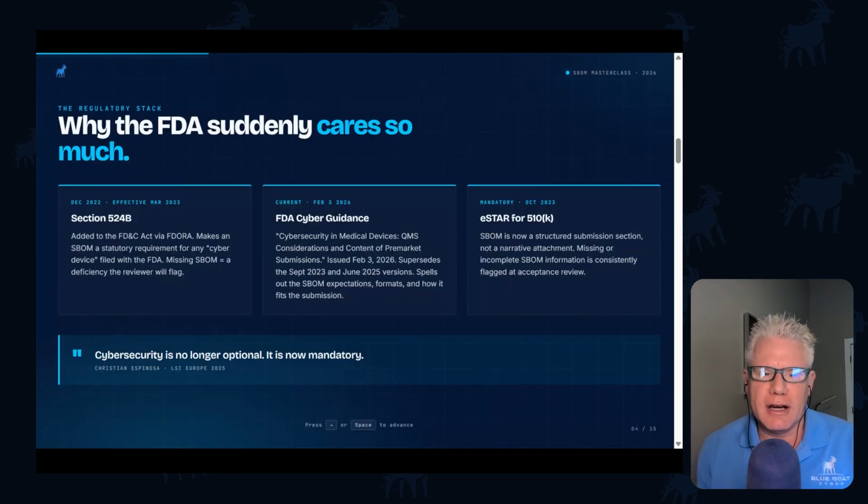So why does the FDA care so much about SBOMs all of a sudden? It's been an evolution. I've been doing medtech cybersecurity since 2014. We did software bill of materials then. They were recommended, but they were not mandated. Now they are mandated as of Section 524B came out in December 2022, which became enforceable in March of 2023. After that date, the SBOM became a mandatory piece of a pre-market submission, 510K, PMA, de novo. It doesn't really matter on your submission pathway. The SBOM is required. And if you're missing an SBOM, you're going to get a deficiency.